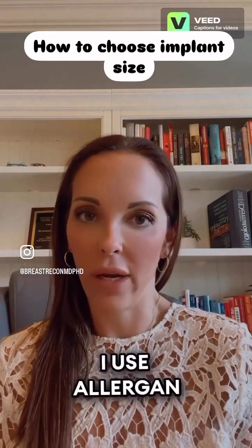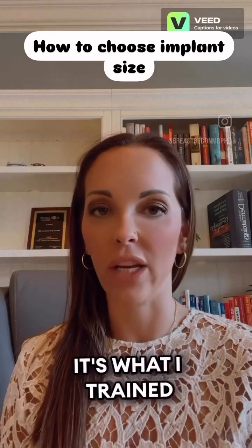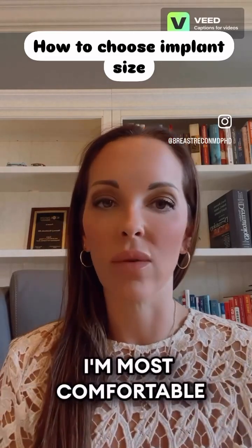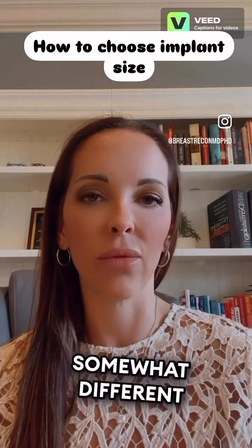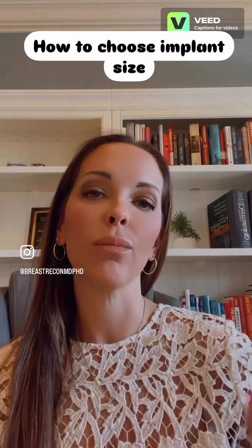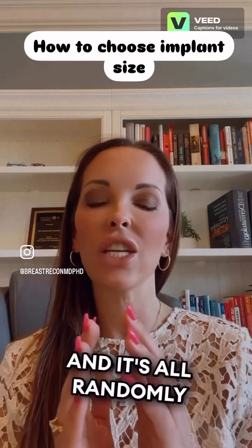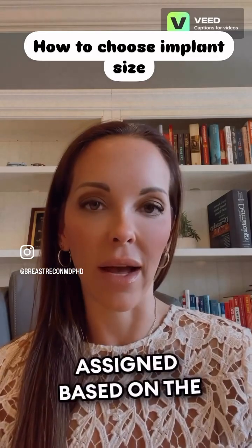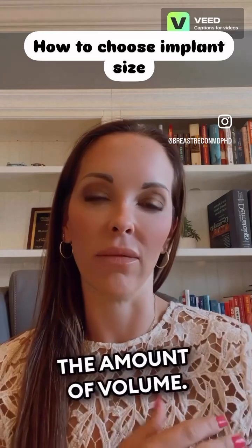I use Allergan implants, and that's just because that's what's at my facility and it's what I trained with, so it's what I'm most comfortable in. All implants have a similar but somewhat different naming structure. Allergan implants have different profiles ranging from low to extra full, and it's all randomly assigned based on the width of the implant and the amount of volume.